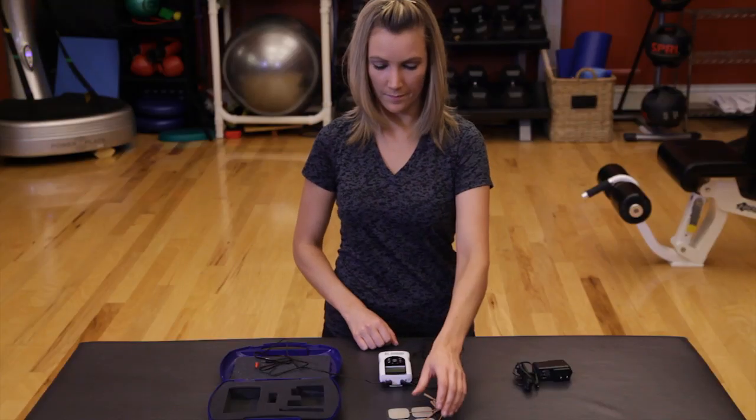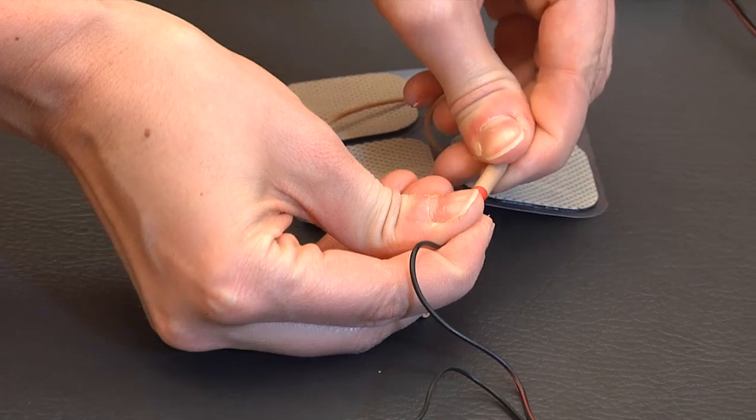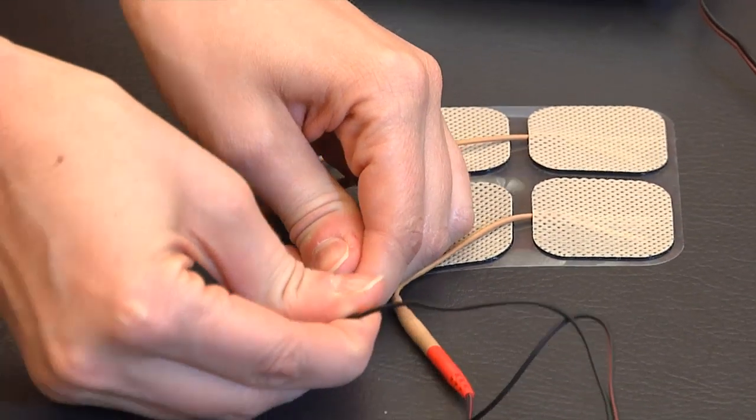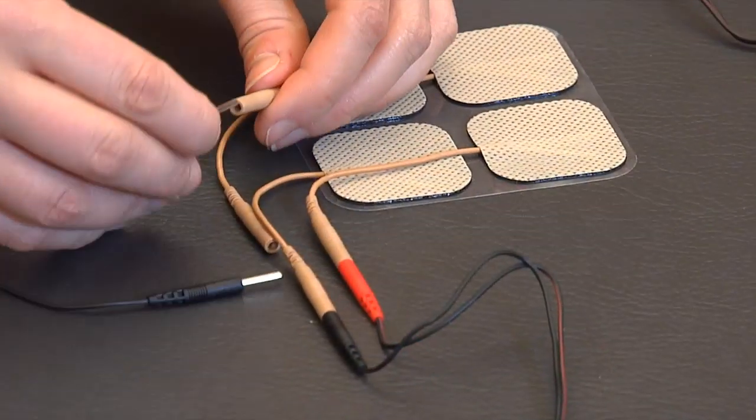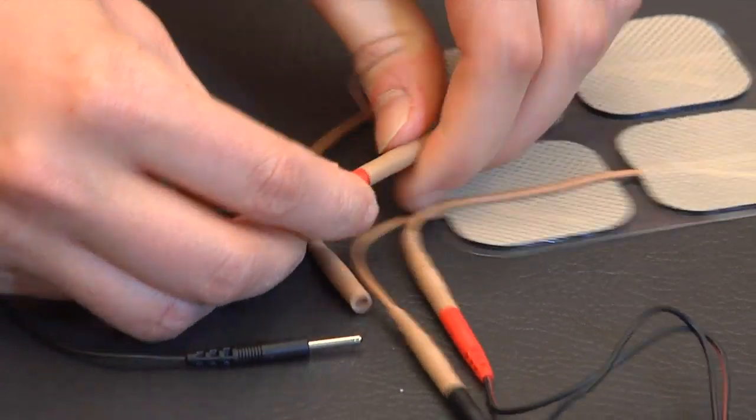Open the electrode package and remove the electrodes that are included with the device. Next, insert the red and black ends of the lead wires into each of the electrodes. It does not matter which lead wire goes into each electrode.